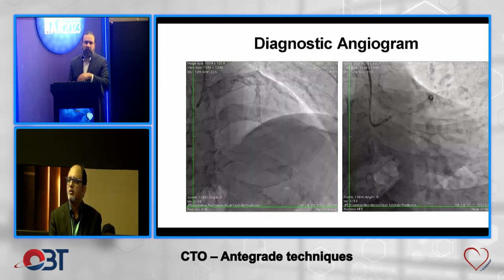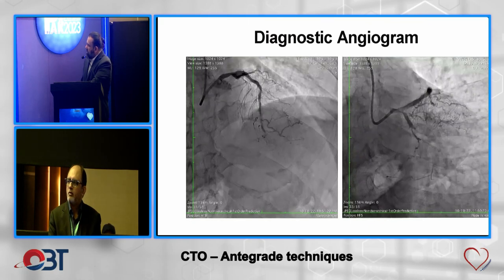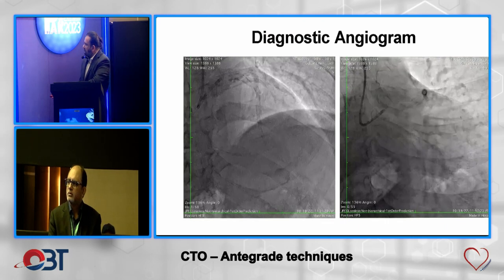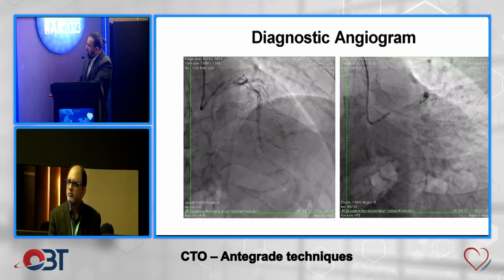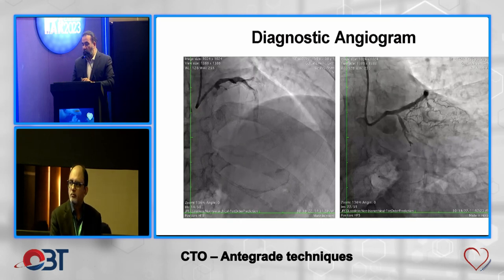So one could argue that, yes, perhaps the ischemia has come from the LAD distribution. What was interesting for me is this large area in the posterolateral section. You can see there's absolutely no blush, but there's movement of the wall, so we know it's living. So there's no blush, but there's movement of the wall, it's living.